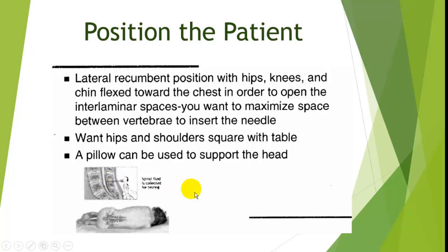Now, it is possible to do spinal taps with the patient in the sitting position, and some clinicians, myself included, find that it's actually easier to have a successful spinal tap with the patient in that position. The caveat being that you don't get an accurate opening pressure if the patient stays in that position. So if you need to get an opening pressure, but you have to have the patient sitting up in order to place the needle correctly, then it would require that the patient be laid down while the needle is actually in position.